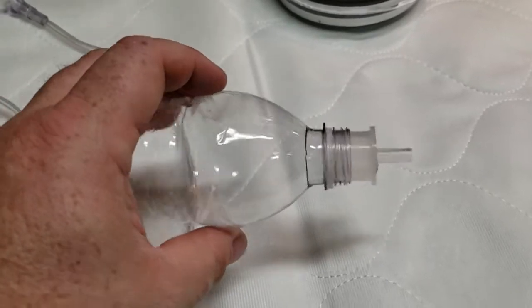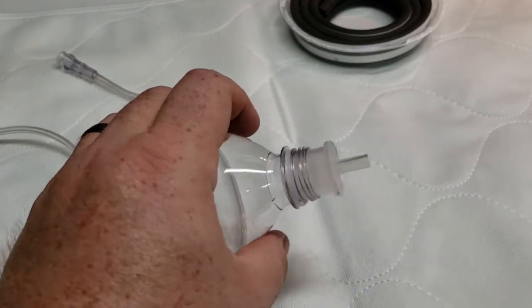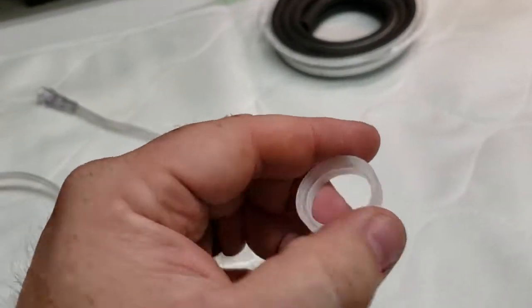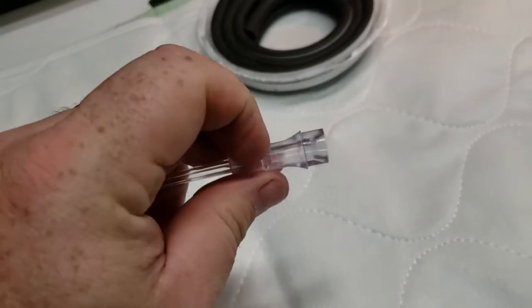So if you want to go that route, that is what it looks like — it fits just snug down into the end of the water bottle. But if you don't want to go that route, you can just drill a hole into the end of the cap that'll fit the tubing. Just measure that out where it'll fit the end of a standard piece of oxygen tubing.